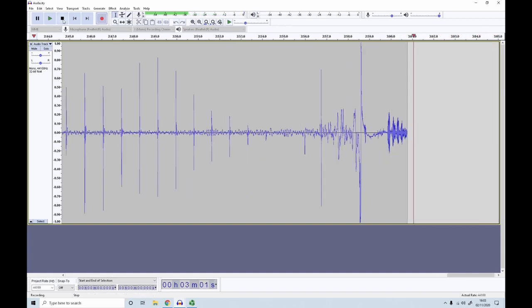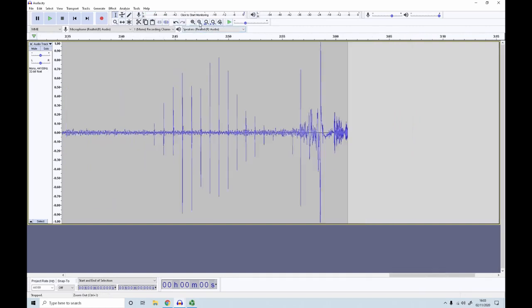Okay, that wasn't bad at all. Let's just quickly take a look at this trace. So let's zoom out a little bit. So this here was where the pressure was declining. It's still above the systolic pressure. And right here you can see that there's the first little pulse of sound that's audible and visible here as a spike. It increases in intensity as the pressure drops.